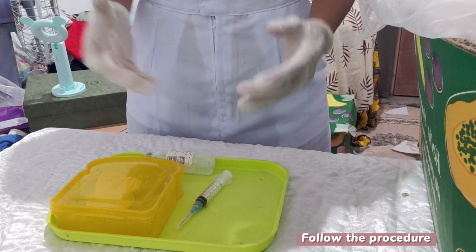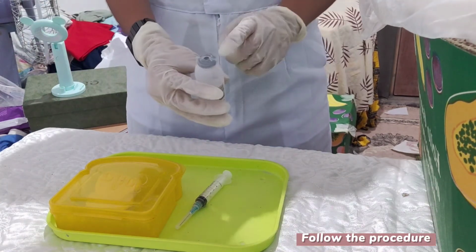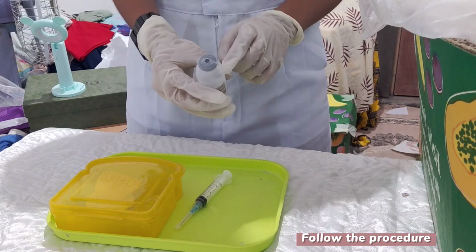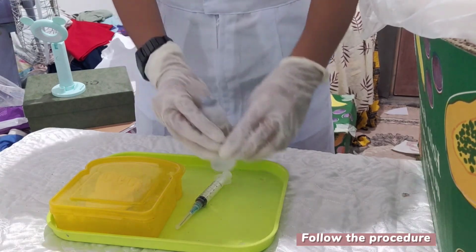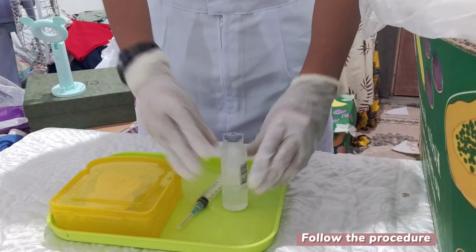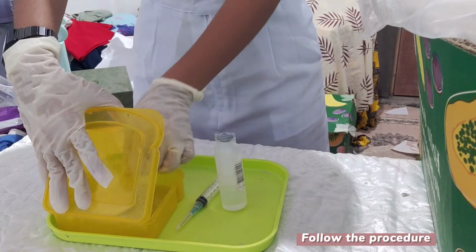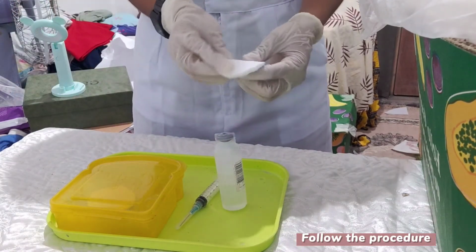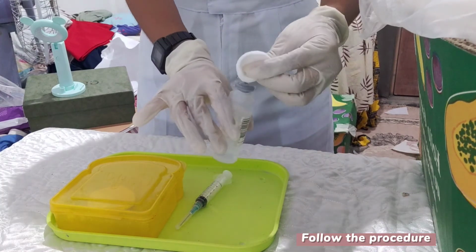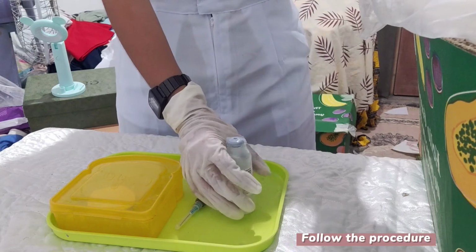Now we will remove the plastic cap from the vial. We will assume that there's a plastic cap because I already used it. Discard the plastic cap, and now we will get a cotton swab or alcohol swab, place it on the rubber top, and discard it.